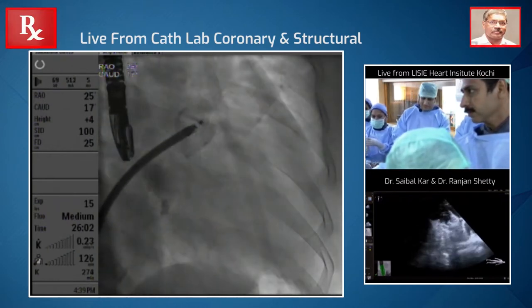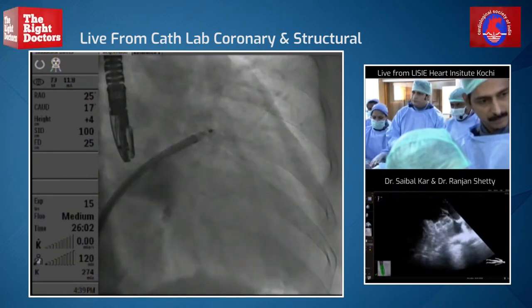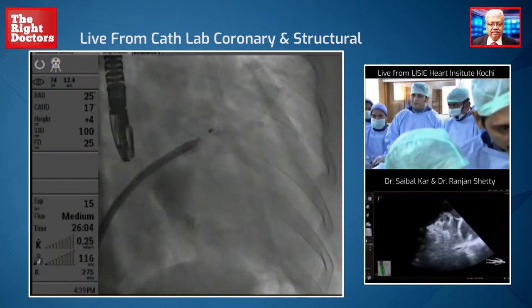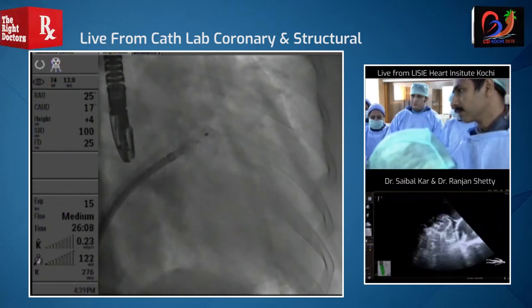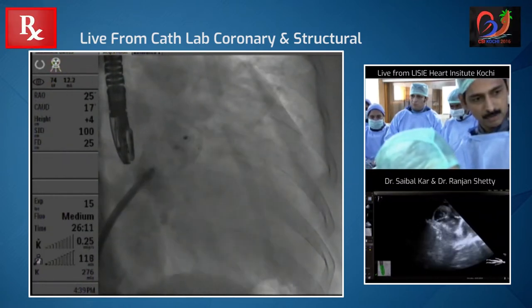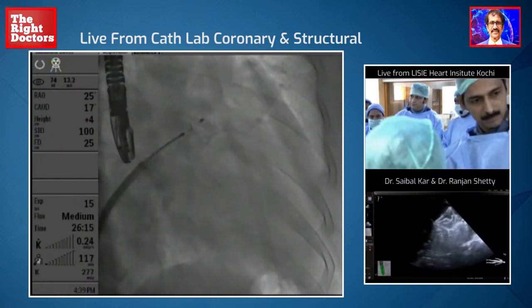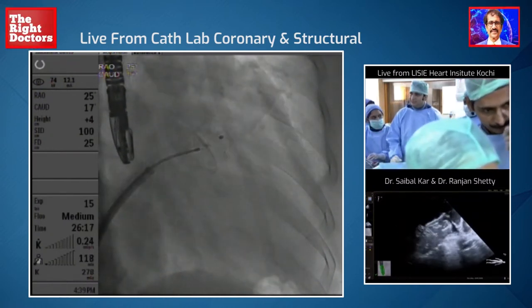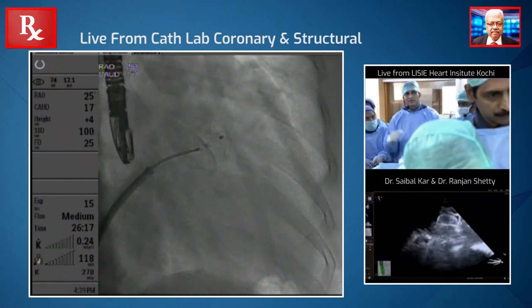We're actually quite not bad inside — we're actually quite good. I like this position and I'm going to deploy the disk. This looks great — so we've actually captured it very beautifully. Did you see that? Can you see the echo there in the hall?